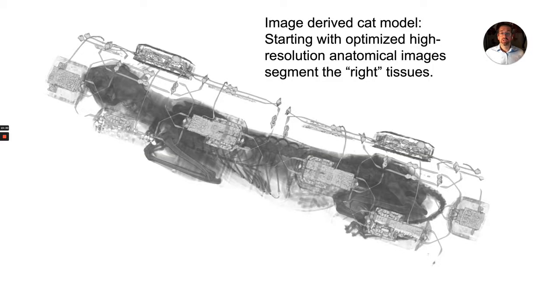I want to now say a little bit more about the work we've started to do using larger animal models, and this work is ongoing. So I'm just giving a general overview of it. Once again, as we're moving to a new animal species, and in this case, interested in the spinal cord in this animal species, our attention really starts with how we're going to actually obtain the images that we will then use to segment the tissue in order to generate the models.